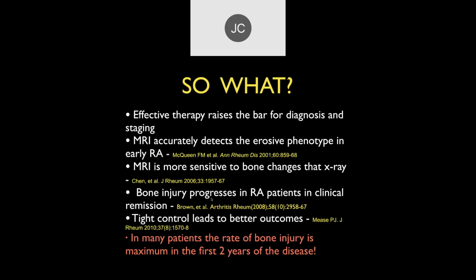Bone injury. The other thing that we found is that bone injury can progress in rheumatoid arthritis even if they're clinically in remission and look like they're doing well.